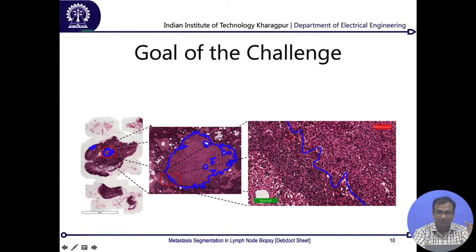So a 1000 cross 1000 pixel tile, you will be having 97 cross 220 such tiles present, and that's not a small number in any way, and you will have to run analytics on them. So this is where the big data deluge comes in for you.